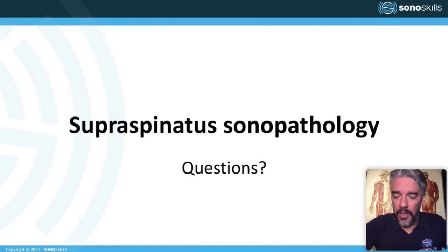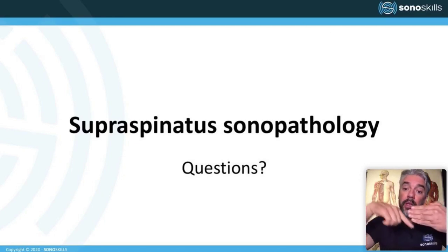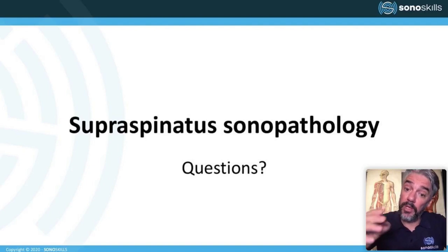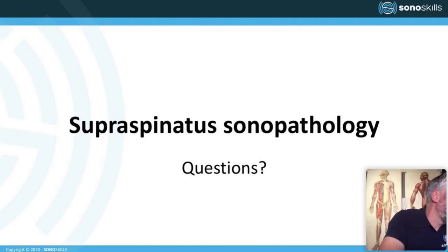And to my knowledge, but I don't do any ultrasound-guided procedures at the moment, I will start doing that in the near future, that is more suitable for barbotage, so with the needle trying to break the calcification. Type 3, softer calcification, is toothpaste-like, and there is sometimes a possibility for aspiration. Good. So thank you for your question.